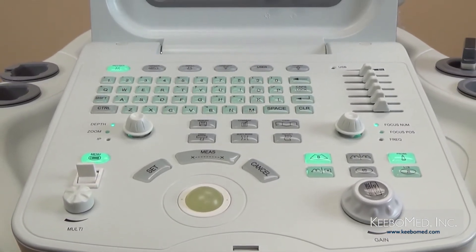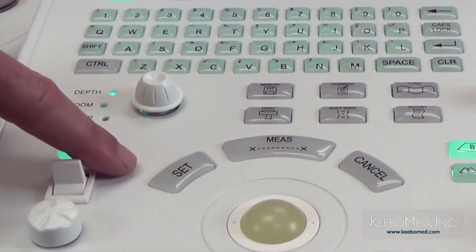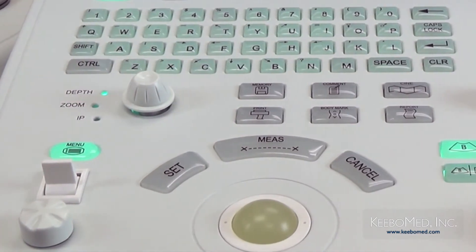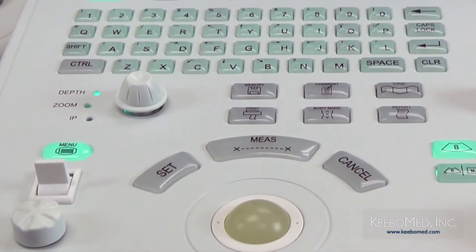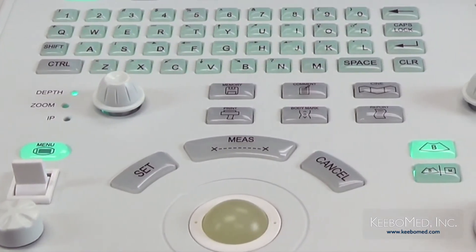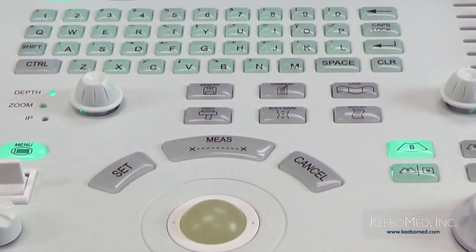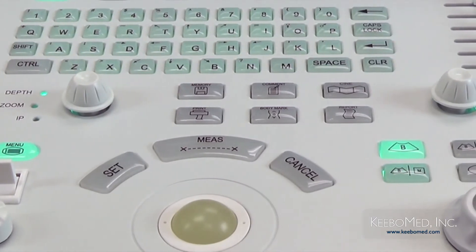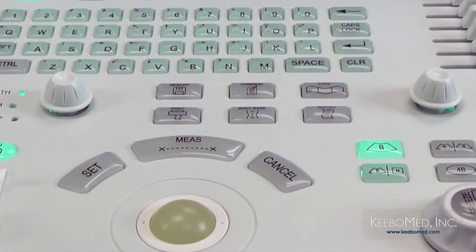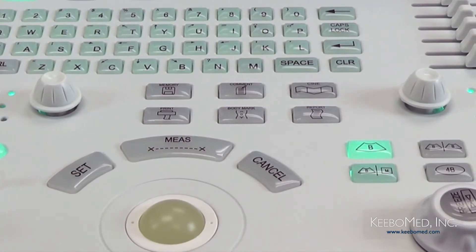Let's get a better idea of the keys around the trackball and know what functions they perform. The first key is the set key — a multi-function key used to make selections, including fixing a cursor position, a comment position, or selecting a menu. On the other side is the cancel key, which also has multiple functions. For example, it can be used to cancel a previous measurement step, or to recall the annotation database when inserting comments.